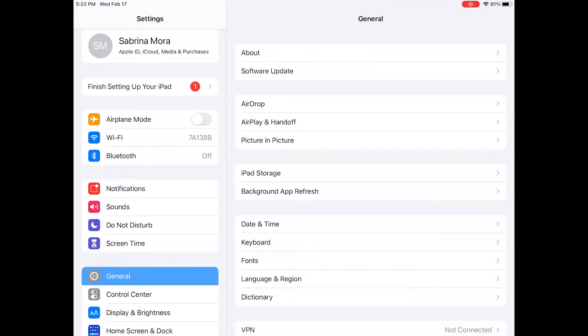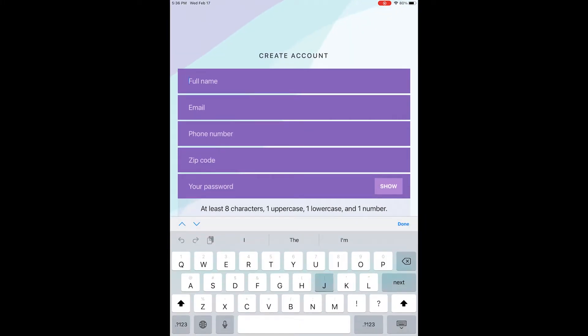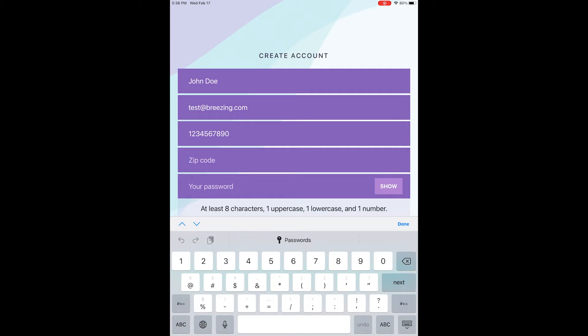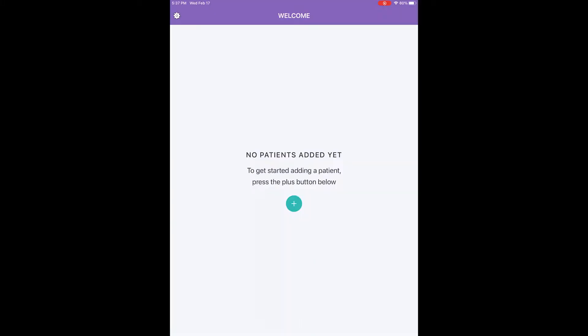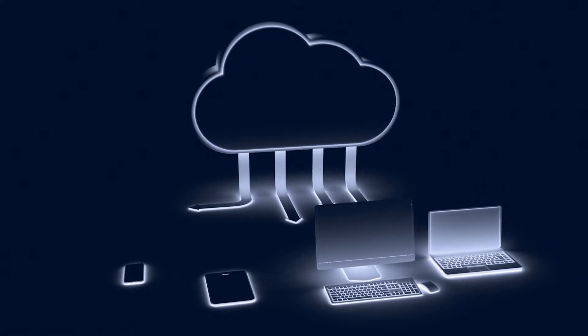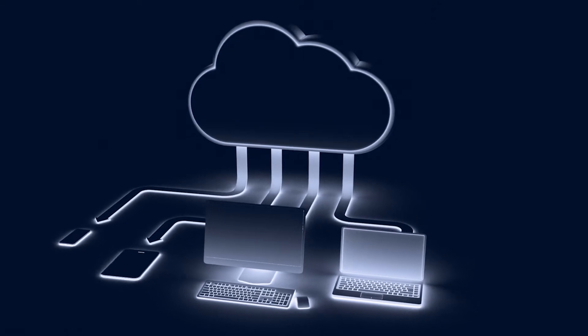Check that Bluetooth is on; the Bluetooth symbol should appear as on in settings. While keeping the mobile device connected to Wi-Fi, open the app and create a user account using your professional email and password. The created account can hold an unlimited number of patients' data, available to the account user only. Make sure the email and password information are stored in a safe location for future access.